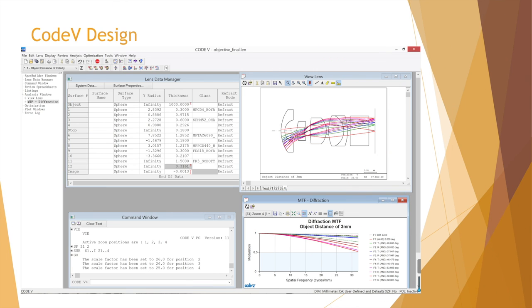This is the interface of the CODE V software. The lens data manager allows us to put in the parameters of the lens diameter, lens thickness, and glass materials. The command window is where we input all the constraints to optimize the system.